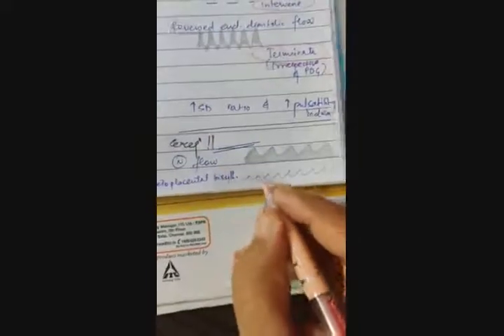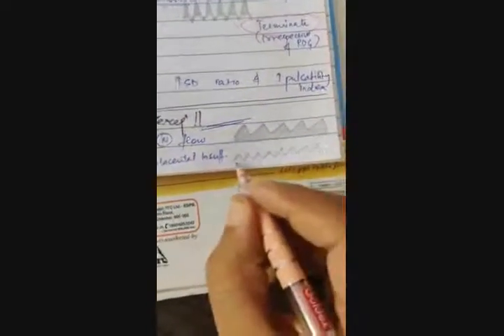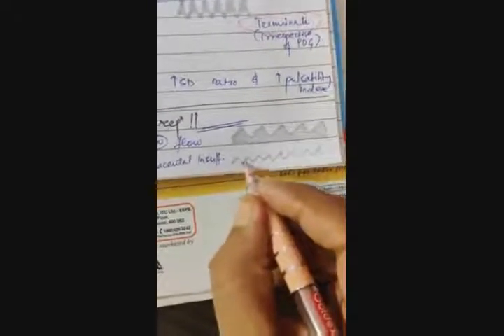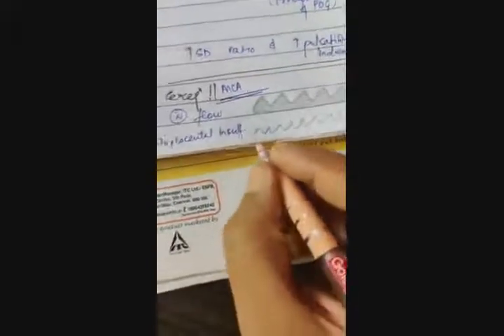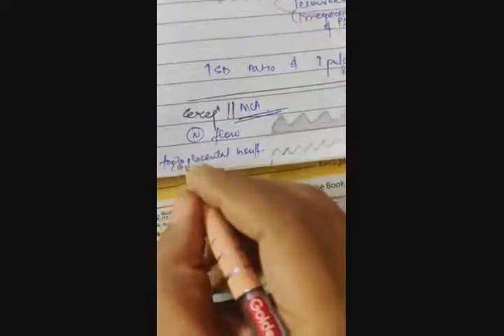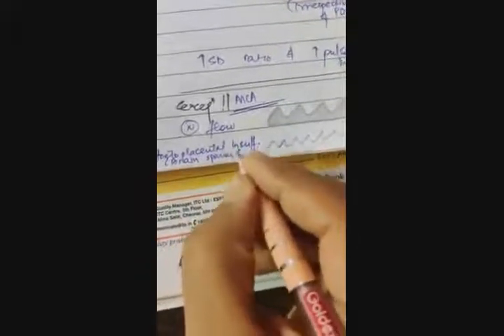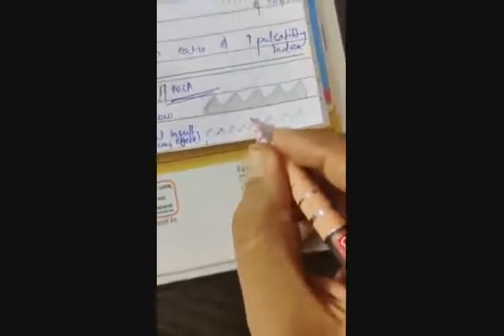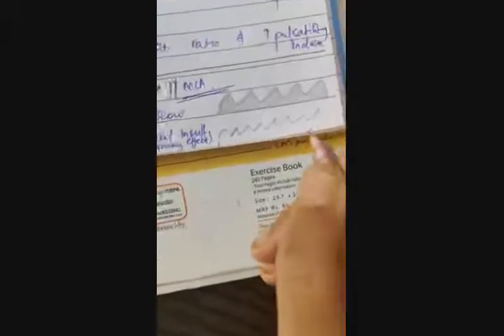Instead, the flow is increasing. The diastolic flow is also going up, multiple notches. That's because it's actually the MCA artery. Let me just tell you before. And this is known as the brain sparing effect. The blood supply to the brain is trying to be maintained using this waveform.